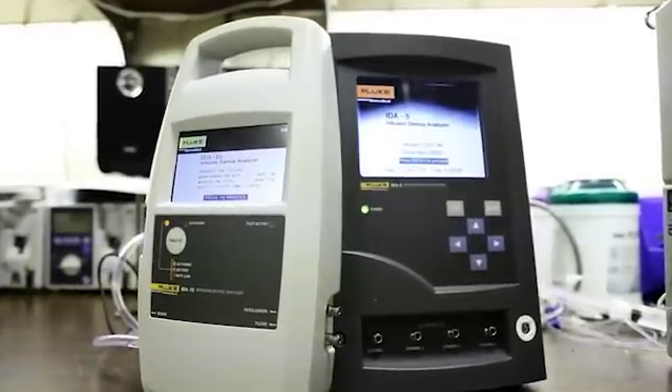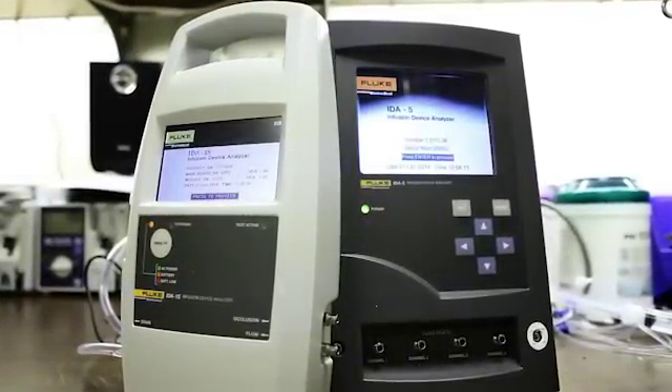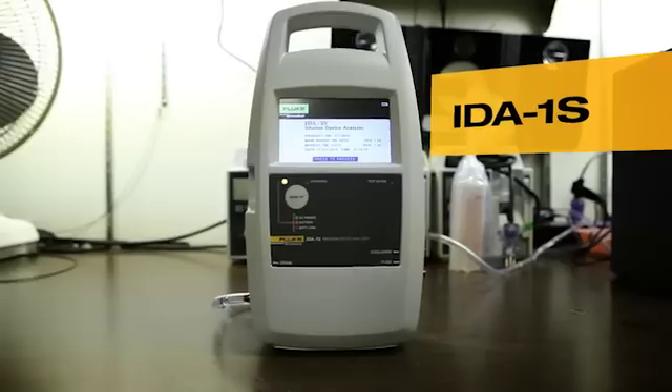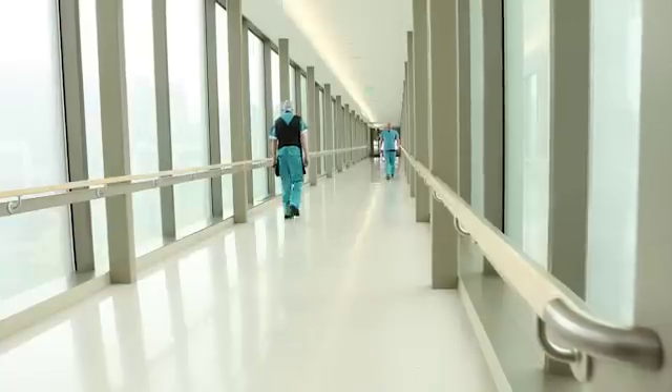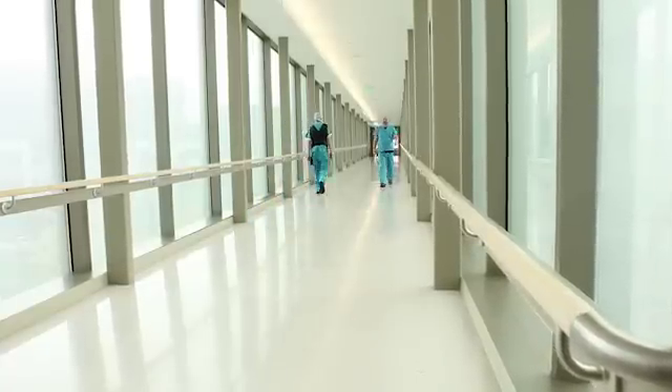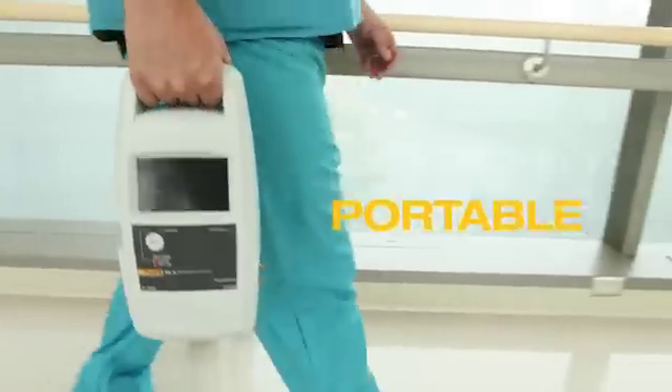You have two different versions. The IDA5 is more for working on your bench. It's not as easy to transport, but you have a lighter version for that. The IDA1S is very light and it's portable. You can transfer it very easily to different places.